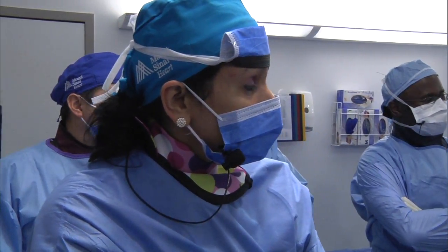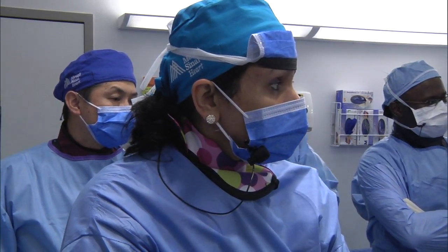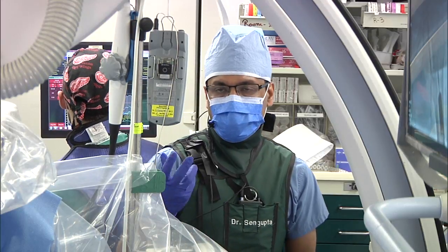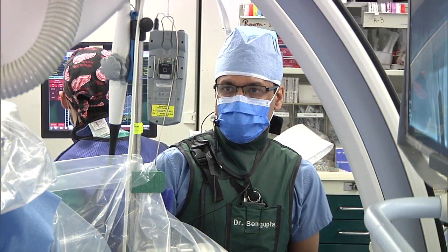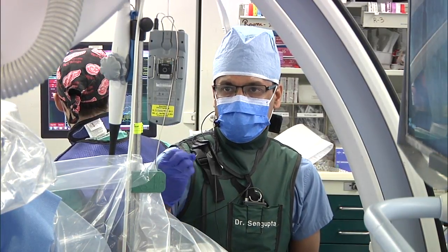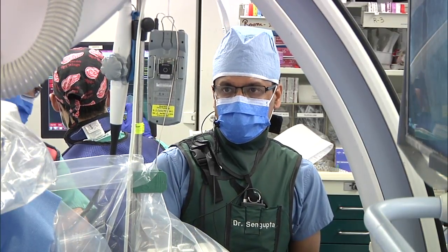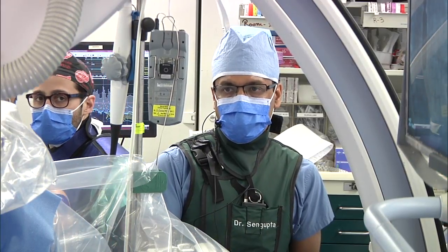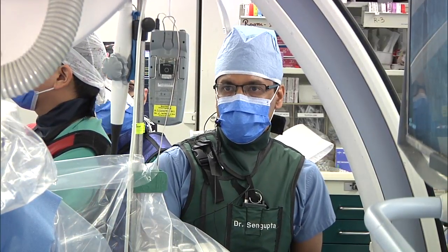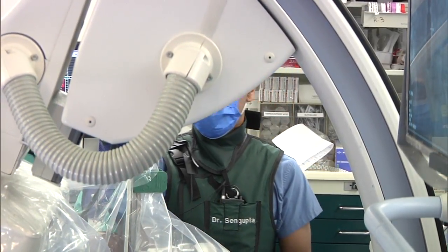Yes. So I think the biggest question is how the valve will expand symmetrically. The questions are how best we can dilate this up front, and what the size of the balloon should be. We thought about 22 or 23, and I will leave it up to the catheter team to come up with a decision. But basically a generous dilatation so that we can break the calcium and open up the valve as much as possible. With regard to CoreValve deployment strategies, I'm not sure I know of any specific way to implant it, but maybe a slightly deeper implant may be useful. But this is again for Dr. Sharma and Dr. Kini to decide.